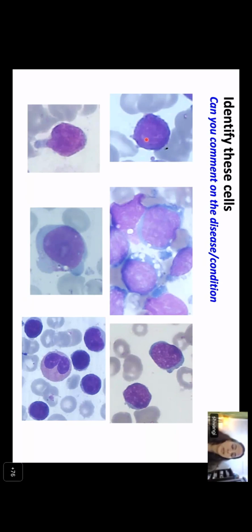So which one is the prominent nucleoli I'm talking about? This thing you were saying as prominent nucleoli? Compared to the blast that you see, for example, let's say this blast and the nucleoli that you can see, which is very prominent, do you think this cell has very prominent nucleoli, or you will consider this to be inconspicuous? It's inconspicuous nucleoli, not prominent.